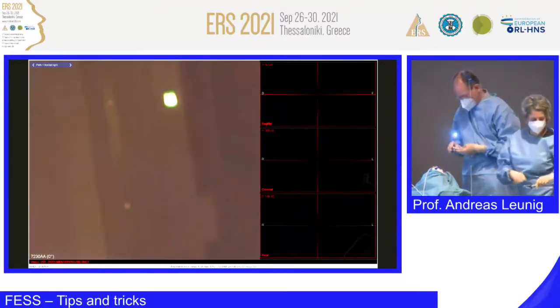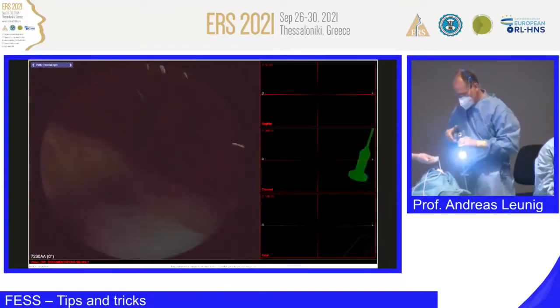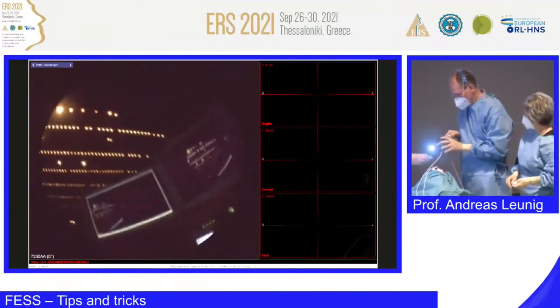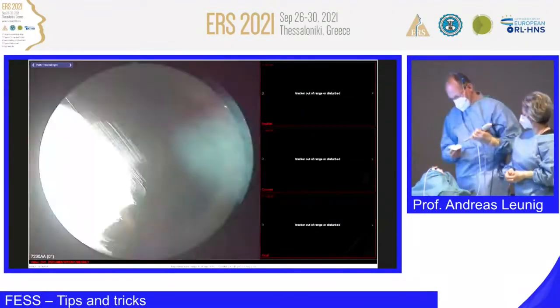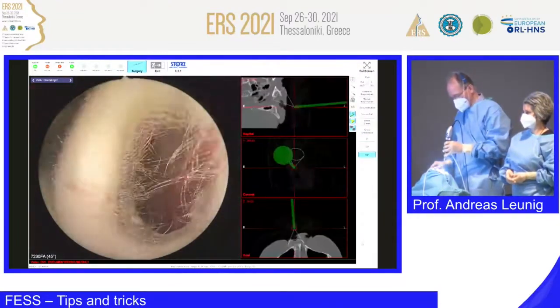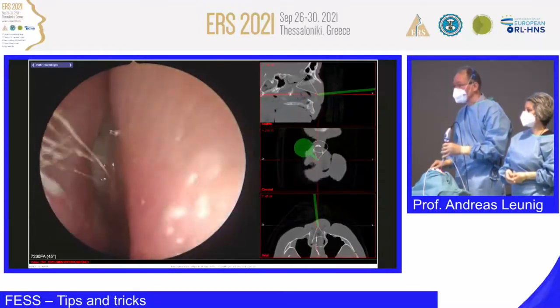Okay. Now I take a 45 degree endoscope. And we're using the navigation system as well, the tracker system. So now, 45 degree endoscope, my favorite endoscope for what? For the maxillary sinus as well as the frontal sinus.